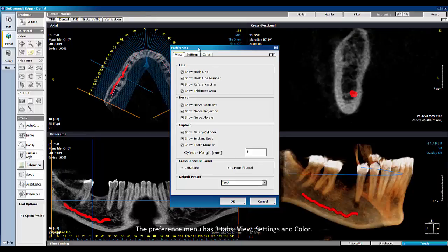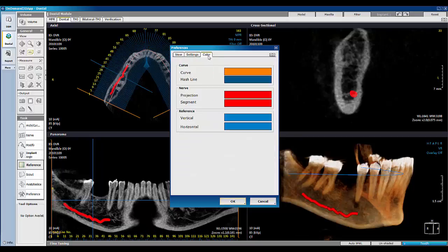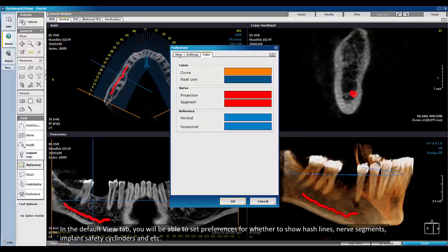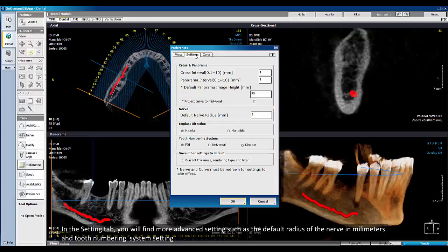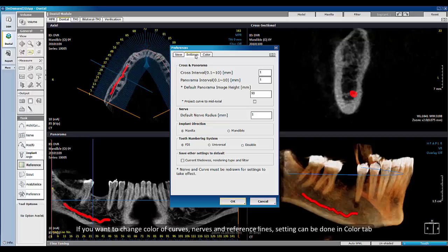The Preference menu has three tabs: View, Settings, and Color. In the default View tab, you will be able to set preferences for whether to show the hash line, nerve segments, implant safety cylinders, and more. In the Settings tab, you will find more advanced settings such as the default radius of the nerve in millimeters and the tooth numbering system settings. If you want to change the color of curves, nerves, and reference lines, that can be done in the Color tab.